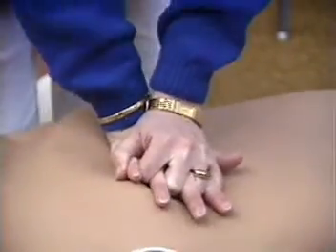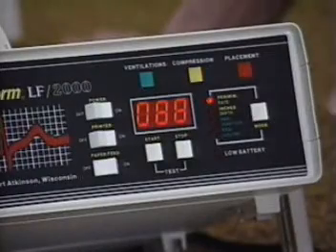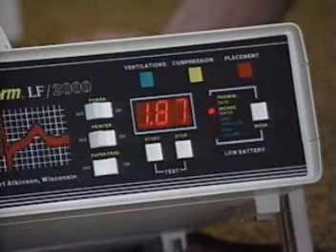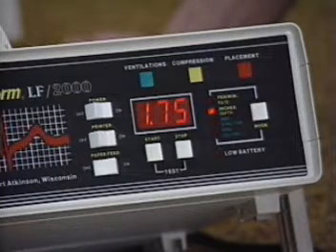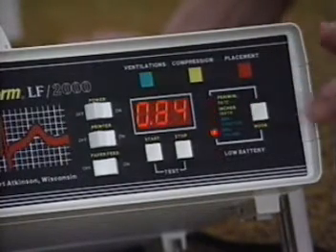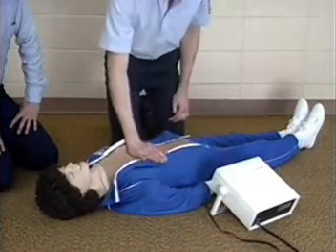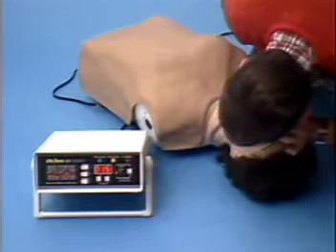To provide more intensive training on proper compression depth, the electronic monitor can be changed to display in the depth mode. While each compression is administered, the red hand placement light continues to monitor improper hand placement. The yellow compression light continues to indicate proper compression depth, and the display will show the exact depth in inches of each compression as it is applied. Again, with the flip of a switch, these levels can be adapted to child CPR standards.